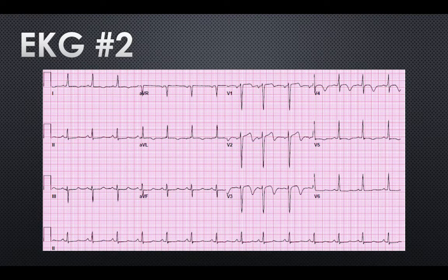So an EKG was repeated once the patient was roomed in the ED. And at this time, if I remember correctly, his chest pain had improved as well. That's correct, it had. But you will see that on this EKG, it's still pretty concerning. There's still that 1 millimeter elevation in V1 through V3, but now the patient has very pronounced T waves as well, especially in V2, V3, but also V4. Well, still technically not a STEMI though, but I'd agree it's concerning with all the diffuse T-wave abnormalities. Maybe he's always had an abnormal EKG.